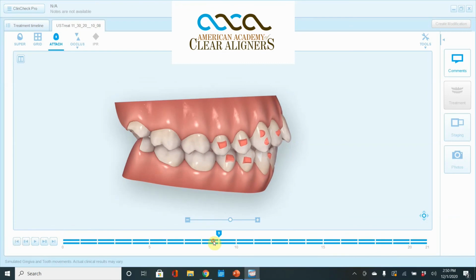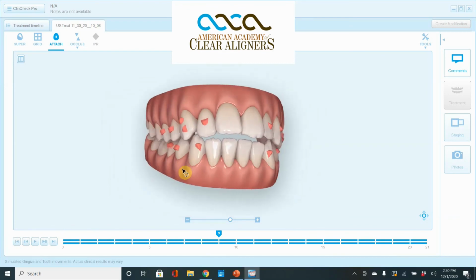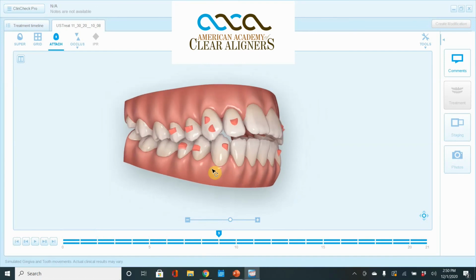Please add IPR distal canine to distal canine in order to close the overjet and use maximum relative extrusion to close the open bite, so that I can delay putting on the G4 attachments till I'm already just a tiny little bit of open bite.